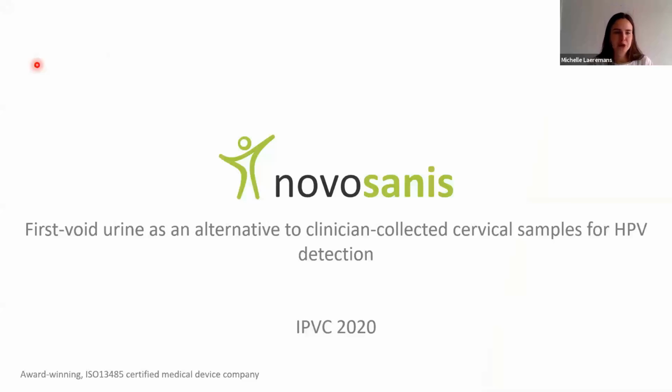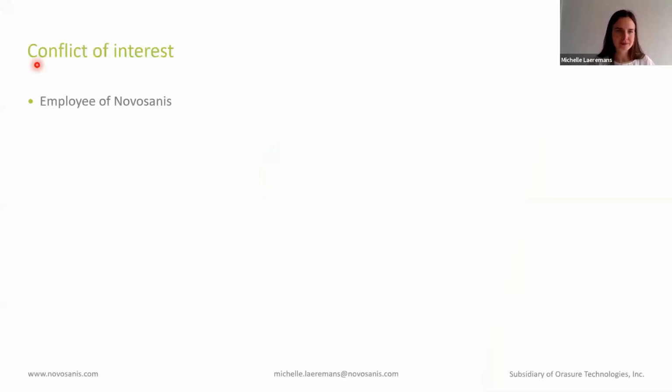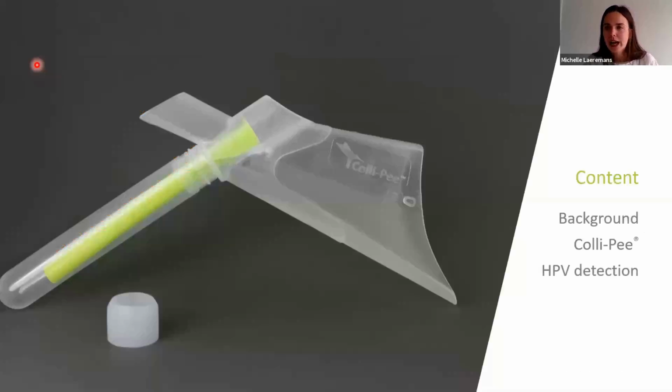I would like to thank you for joining our presentation on first void urine as an alternative to clinician-collected cervical samples for HPV detection. I will present usability and performance data of Colli-Pee, a urine collector for the standardized and volumetric collection of first void urine, which is developed by Novosanis.